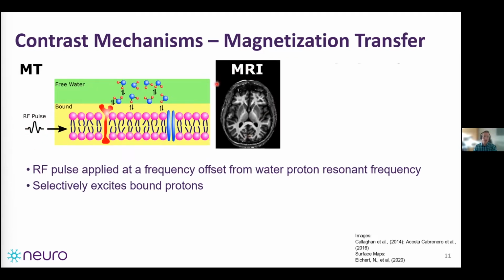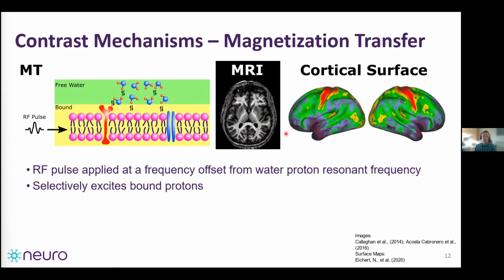So this one specifically is an MT sat map, characterizing the saturation that occurs as a % signal drop of the image from the saturation pulses. Again, it looks very similar to the R1 maps, and we can also project this onto the cortical surface.